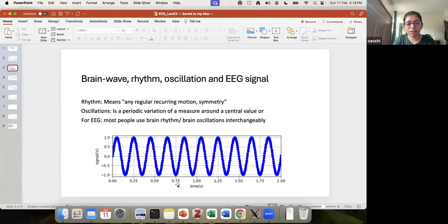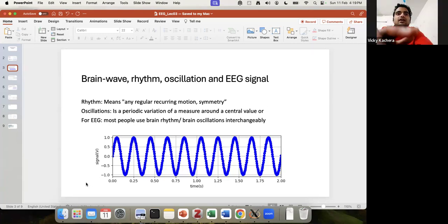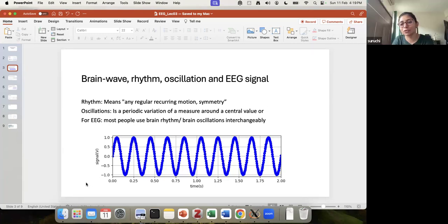Great. And then there's the sampling rate, which is related to the number of dots. You will have to count all the dots up until 1 second, and see how many dots. I think this was sampled at 100. How can we count the sampling rate like this, ma'am? You can't count. You'll just know that your device is measuring at 500 per second. When you do mathematical analysis, you need to know that, right? So that is something that is in our control.